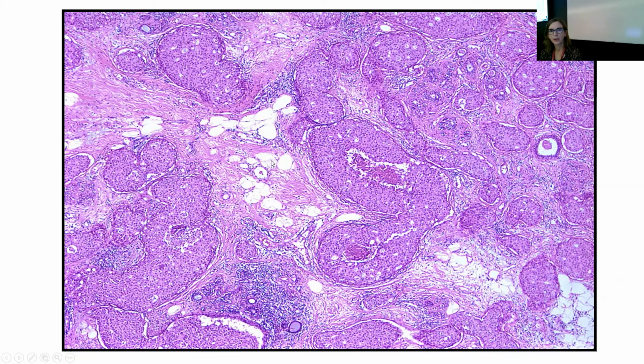And here, the final mimic of DCIS. This is extensive lymphovascular space invasion, and this is really tricky, right? So it looks exactly like DCIS, rounded nests, comedonecrosis, some cribriform spaces. The clue here is to look for these normal terminal duct lobular units interspersed in between. That's not really a normal pattern for DCIS. It doesn't typically skip areas.